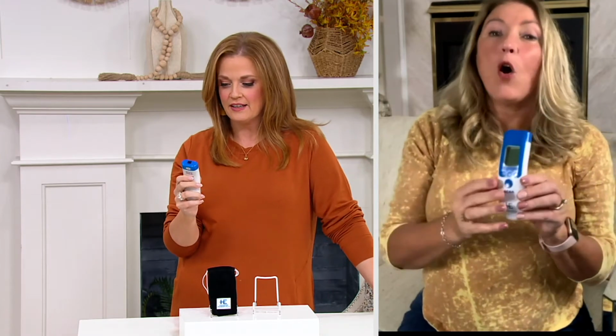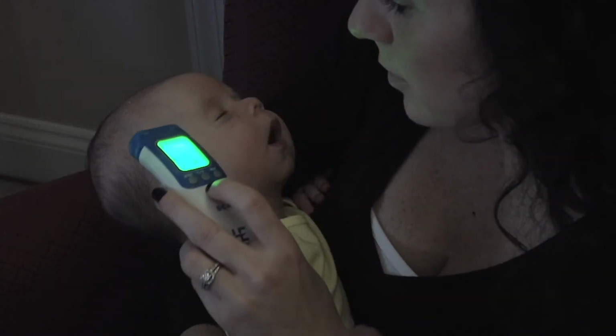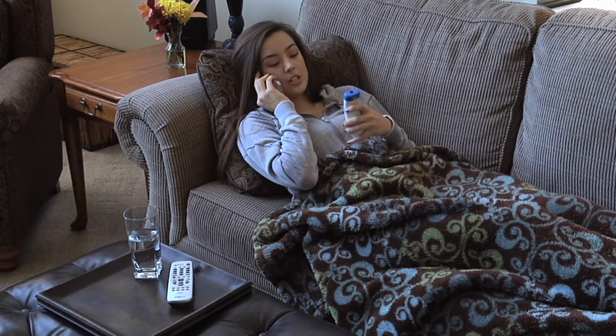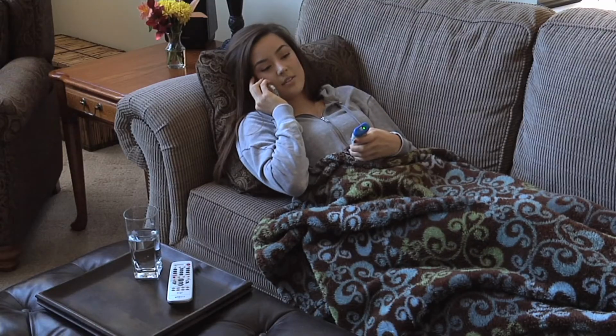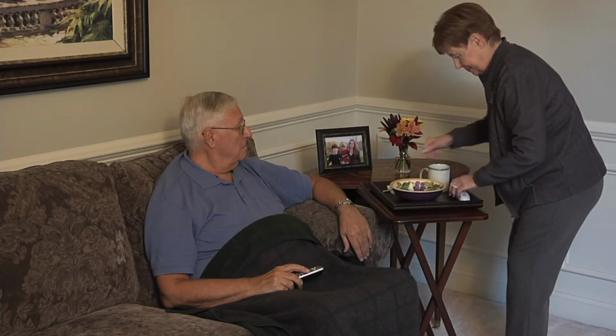Yeah. And also, I just want everyone to know that the backlighting that I was just speaking of is green if it's a normal temperature, yellow if you're in the danger zone, and it'll backlight red if the fever's elevated. That is for the body mode. Okay, so it's not going to do that for the surface or the room mode. Although, Mary, I do use the room mode a lot, I have to say.